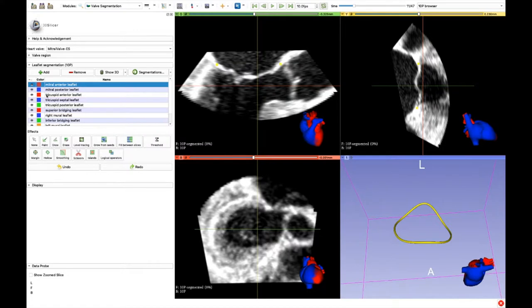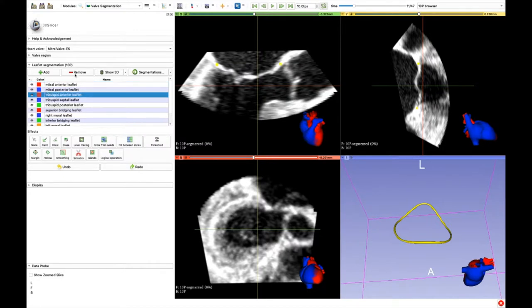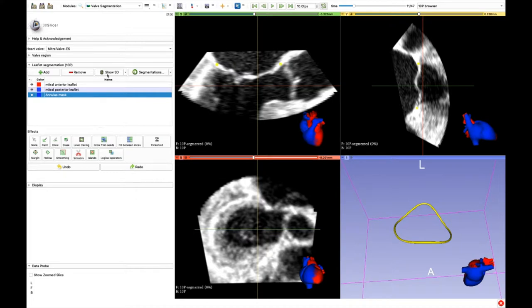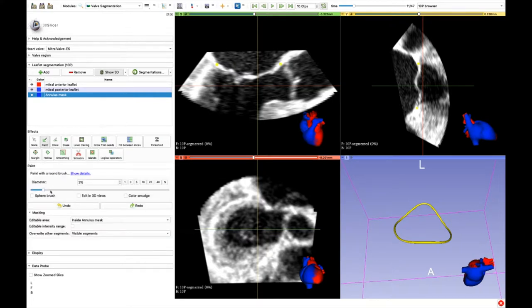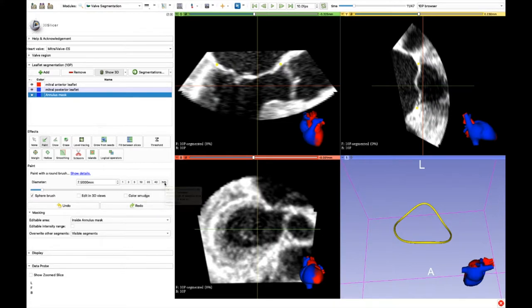Now we erase all the unnecessary labels. We select Show 3D and we select the paint tool. By clicking on the sphere brush we'll use a 3D paint brush, allowing us to draw on more than one slice at the same time.